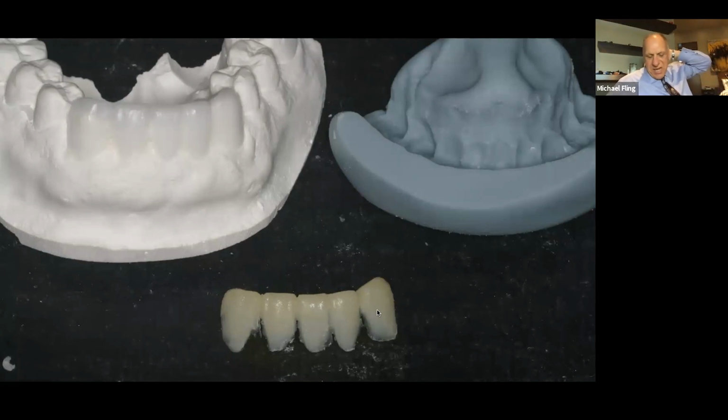In this case, I used Luxa Crown. Okay, Luxa Crown is the bisacryl material from DMG. And again, at the time, I was just screwing around with different materials, trying to figure out what works and what doesn't. But this can be a little deceiving. This is a thin shell of material. That's not solid. It goes down the facial wall, it goes over the incisal, and then I run it here onto the lingual so that it's hollow on the inside.